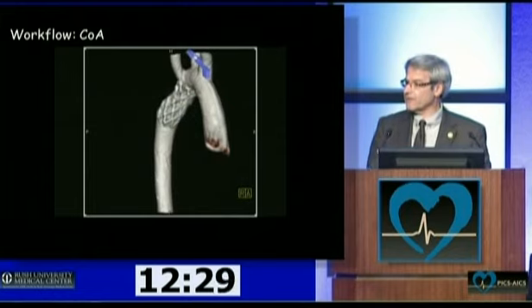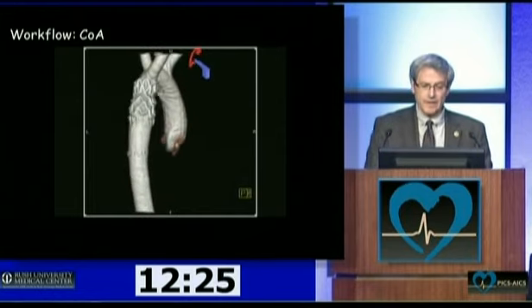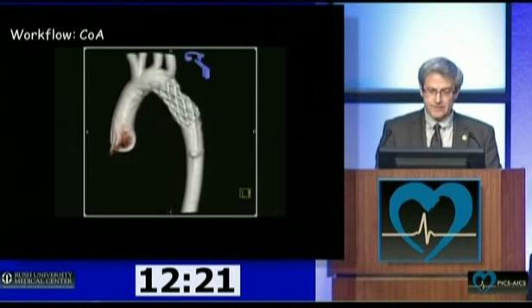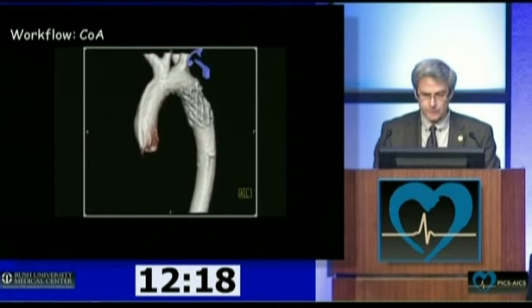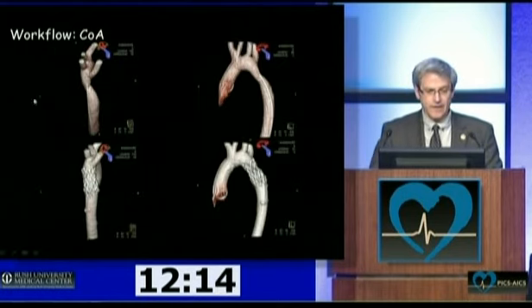And this is the final image. We don't repeat biplane angiography. We just do a Dyna-CT. But again, this is a research study. So this is the kind of information you can get.